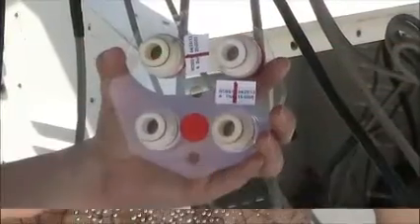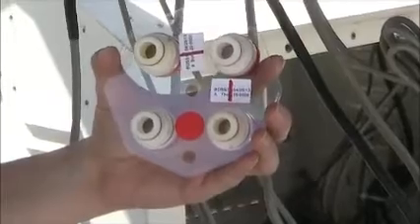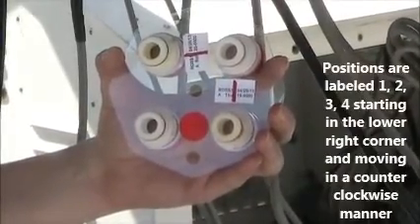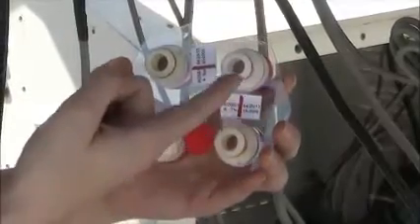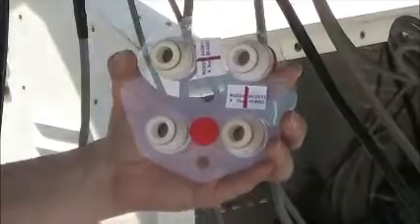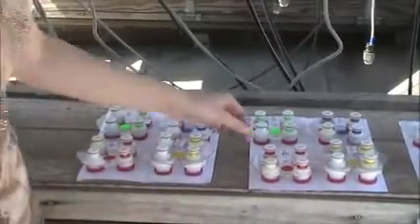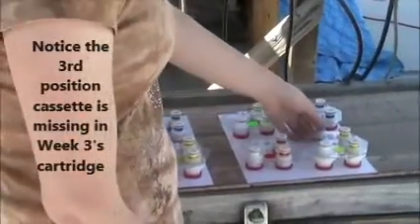Each of the cartridges also has 4 positions, with the cartridge oriented in such a way that the 2 holes in the cartridge are facing down. The positions are labeled in a counterclockwise manner, starting with the lower right. Weeks 1 and 2 will have a full set of 4 cassettes in all of their cartridges, while the week 3 cartridges will have an open hole in the 3rd position.